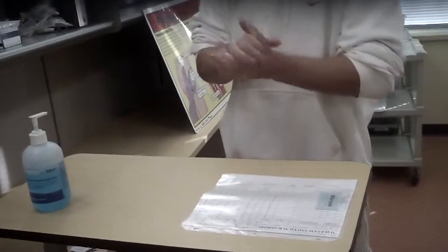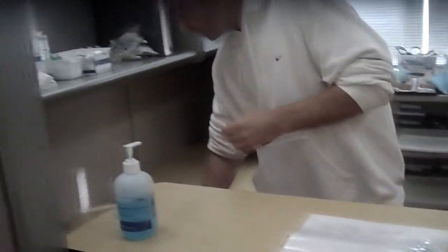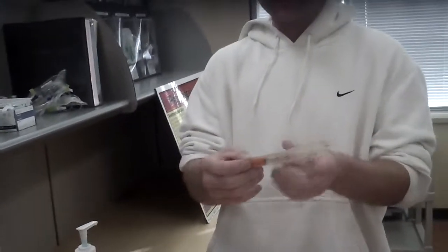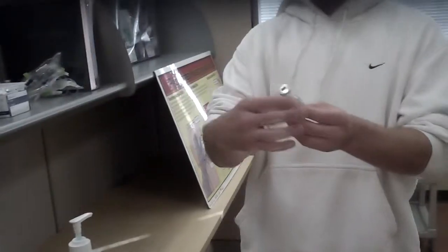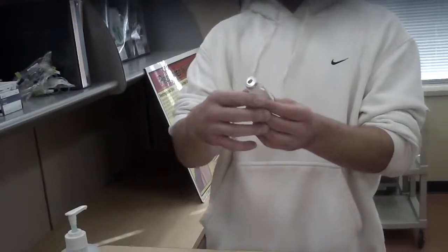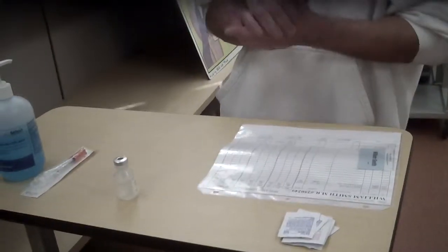I will then look at the equipment that I will be needing, and seeing as how I'm giving 5 units of TB, I will take my 1 milliliter 29 gauge half-inch insulin needle. I'll also have my purified protein derivative, 5 tuberculin units. Expiration date is good. I will also have some alcohol swipes for disinfecting asepsis.